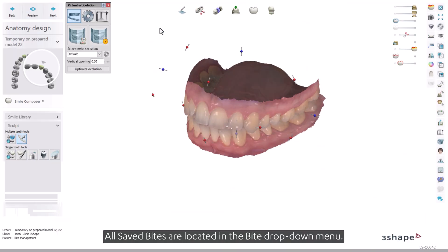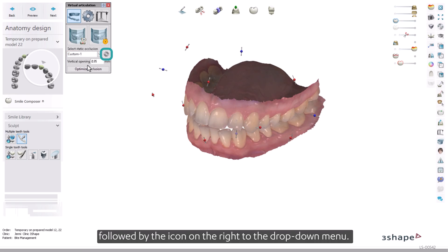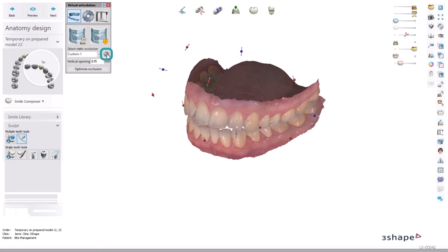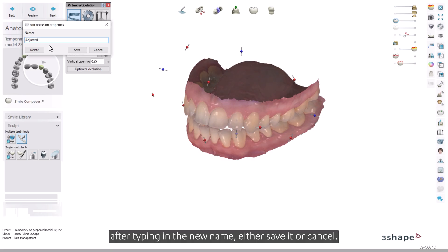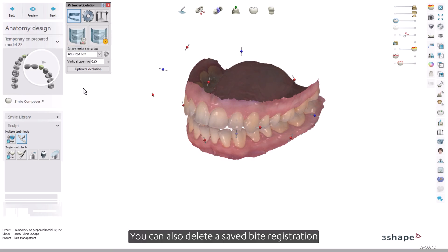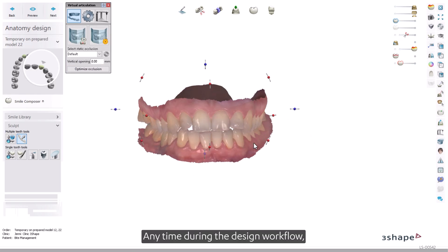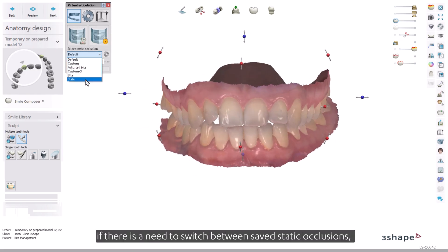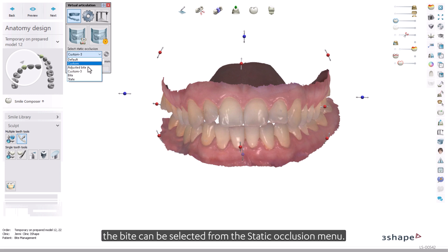All saved bites are located in the bite drop-down menu. Bites can be named for easier identification by first selecting the bite, followed by the icon to the right of the drop-down menu. In the Edit Occlusion Properties window, after typing in the new name, either save it or cancel. You can also delete a saved bite registration by selecting Delete. Any time during the design workflow, if there is a need to switch between saved static occlusions, the bite can be selected from the Static Occlusion menu.